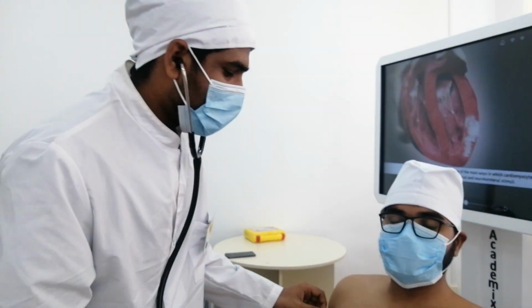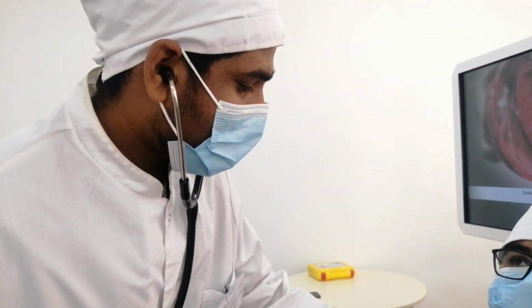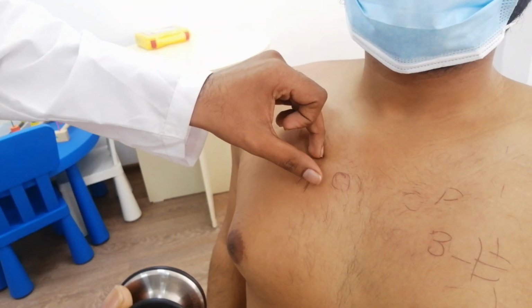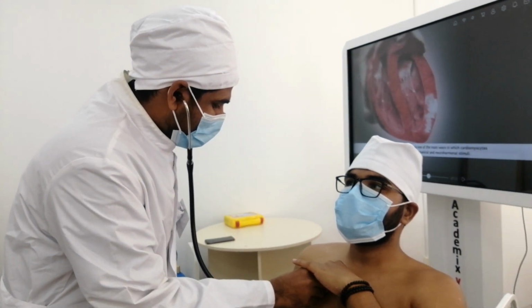The second point is the aortic point, which is on the right side of the sternum, at the clavicle, second intercostal space near the sternum. Aortic valve point.